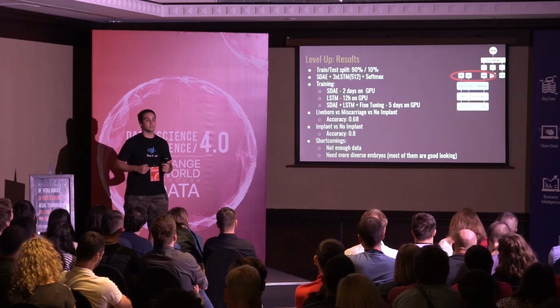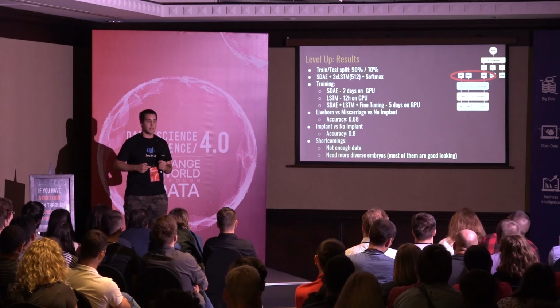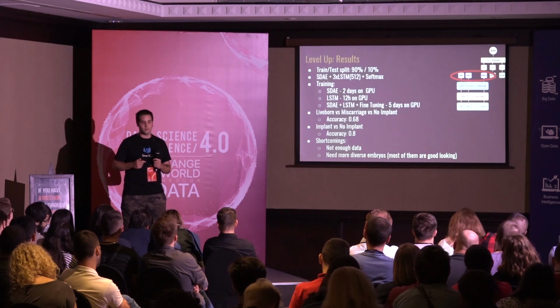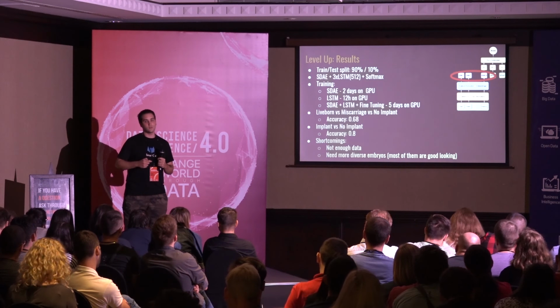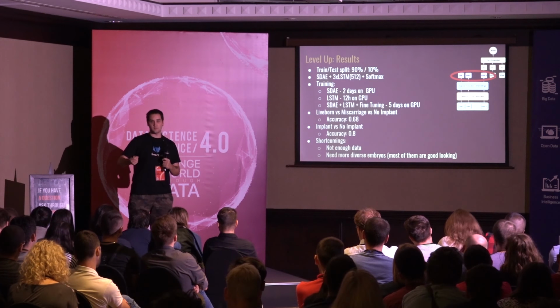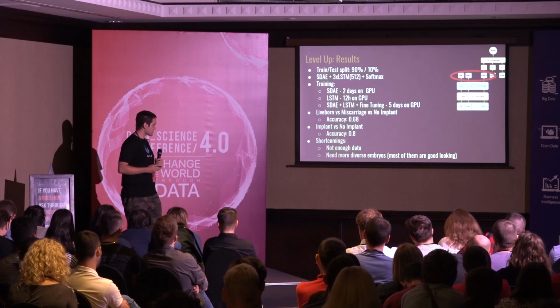There are some shortcomings: we need a much bigger data set in order to produce better results, and we need more diverse embryo videos. For example, almost all videos were good-looking embryos. That means these were almost all embryos that were transferred into the mother. The doctor looked at the video and said, hey, it's an okay embryo, we can transfer it. And from these embryo videos, we got liveborn, miscarriage, and no implantation.